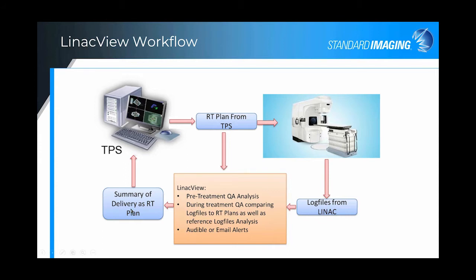And afterwards, if you have a case that you have received an alert on, and you want to investigate further, there are all kinds of tools, as I was saying previously, and then you can export an RT plan and feed that back into your treatment planning system to review the plan in a clinically meaningful way. So that's just the overall workflow of LinacView.